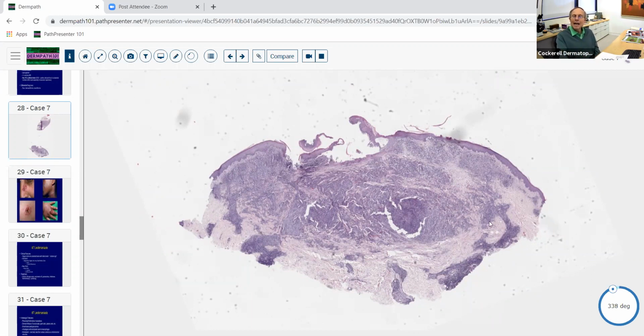So some of these cells in the background too are lymphocytes, but others you can tell are not quite as dark. So I'm going to just tell you from looking at a couple of million slides over the years, some of these are going to be plasma cells. You're going to say, well, how did you know that? Well, again, I don't necessarily think you need to know that. When you go to higher magnification, you're going to see that some of them are, but it's because they're not quite as dark at low magnification as plasma cells, and they're a little bit different color and tinctorial characteristic than neutrophils. But the pale cells are histiocytes. We can all agree on that.